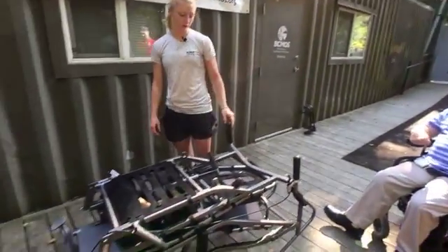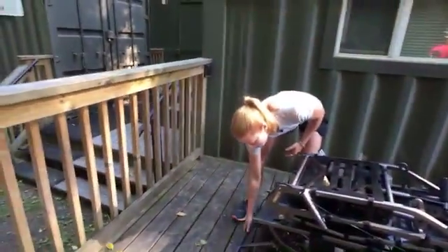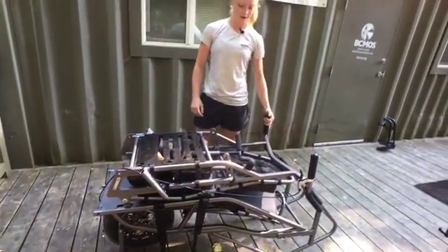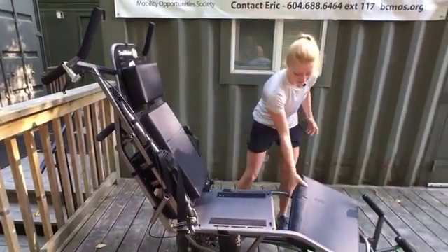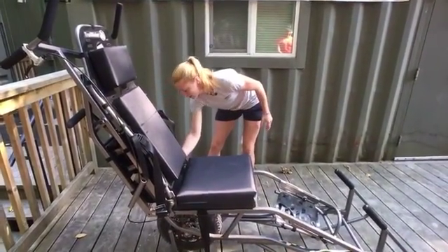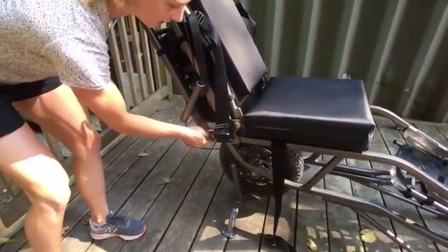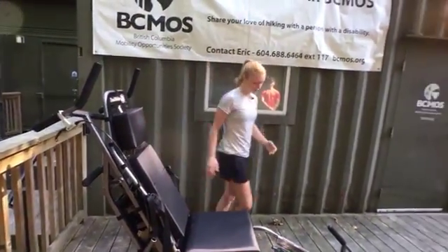All right, so the first step with the Trailrider is we always want to put the kickstand down. This is what makes it nice and stable, so it's not going to tip over. So that's what we'll do first. It then unfolds and opens right up, just like a chair. We have a nice comfy cushion for it, and some pegs on either side here that just help hold it in place. So I'll put those in, just like that. So now it's pretty much set up.